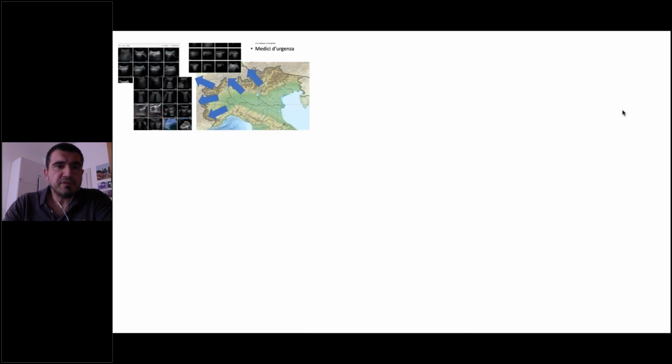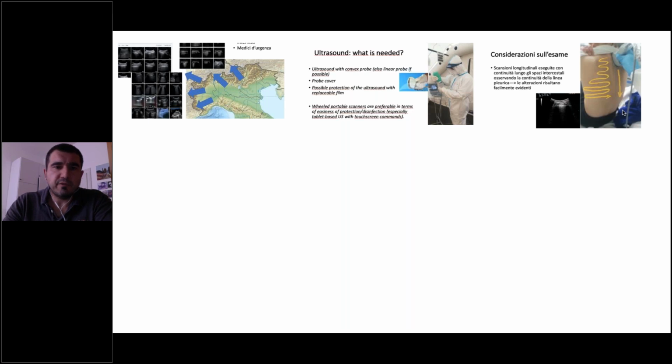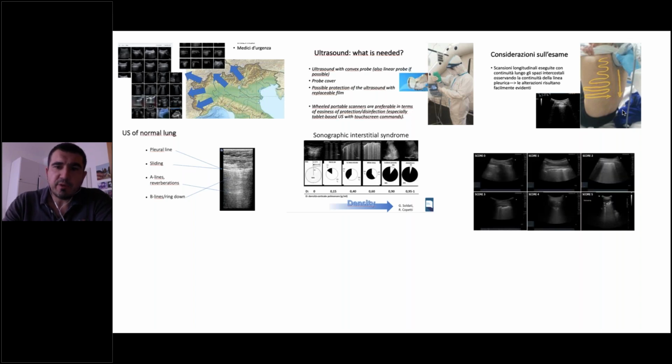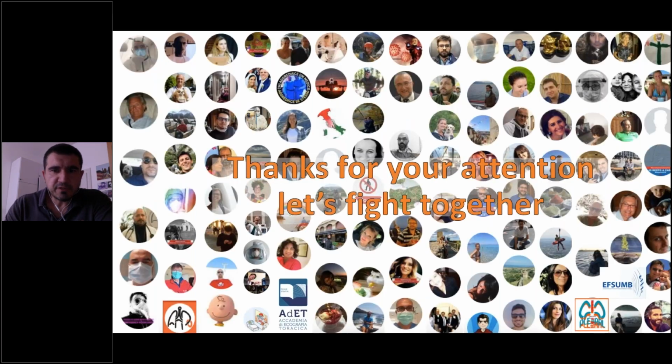In conclusion, we have seen how the outbreak spread and how knowledge exploded from northern Italy about the use of ultrasound in COVID pneumonia. We see what we need for performing this exam and how to perform it. Lung, we know, is difficult to study in the deep of its parenchyma, but the loss of air makes it explorable by ultrasound. So with our scoring, we can assess the severity of the disease, make a good triage and diagnosis of pneumonia, and then manage all the problems we can meet in the intensive care units and other wards. Thank you very much for your attention.